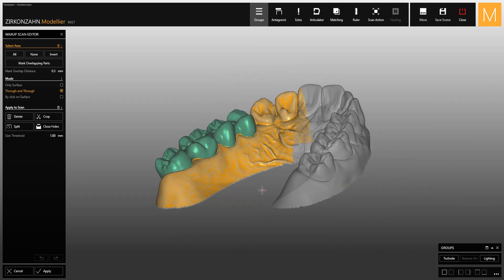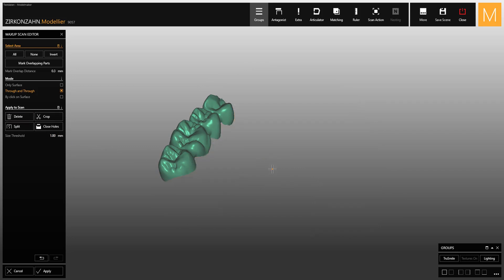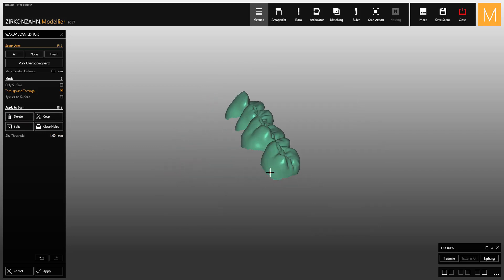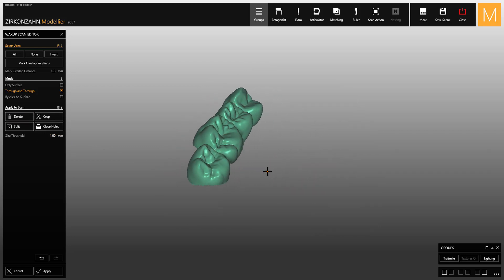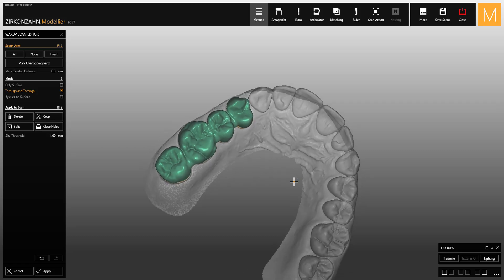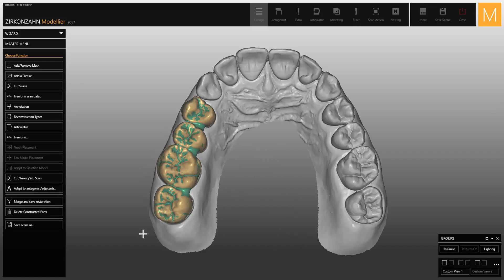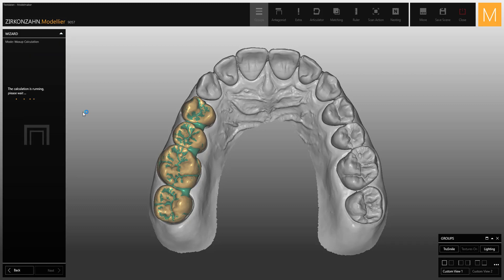Here it is important to cut away any areas that are not part of the structure. When you're done, click Apply and open the wizard to proceed with the design.